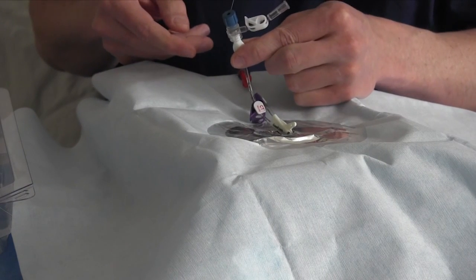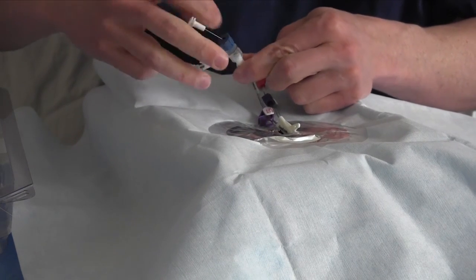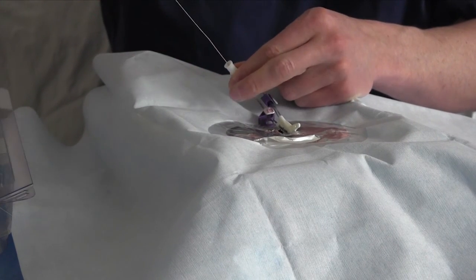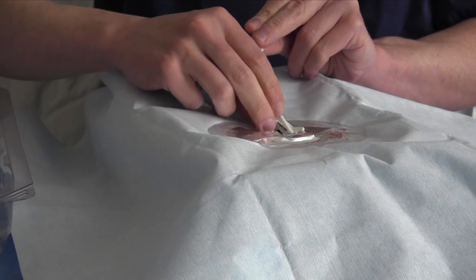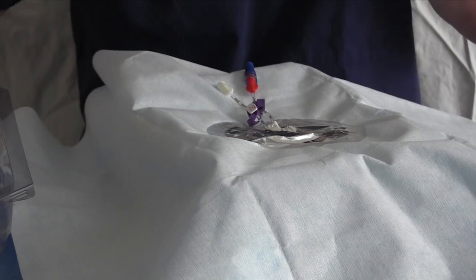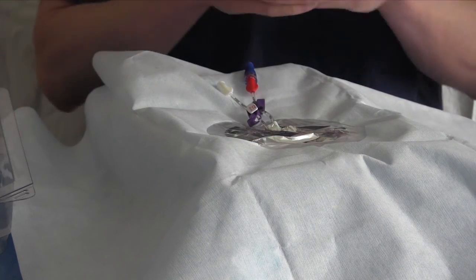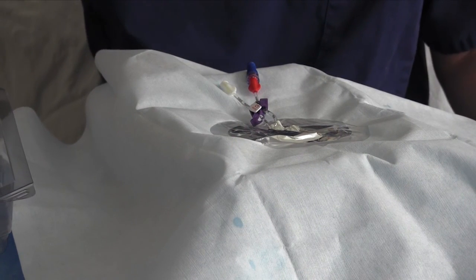Next, I'm going to take out the entire side portion with that wire in it in one motion. So I'm going to unscrew it and then take out the wire and the side portion. And I could clamp this for now. And now I'm going to take my second syringe right here. I'm going to put on that last cap.